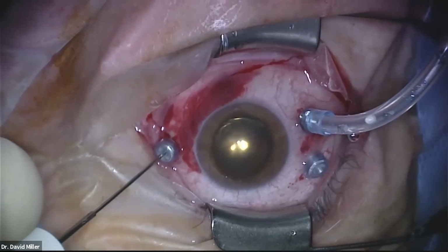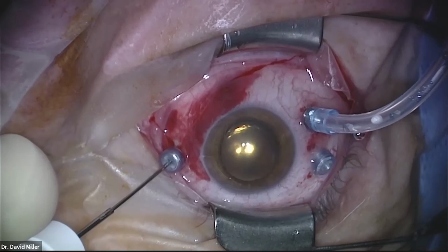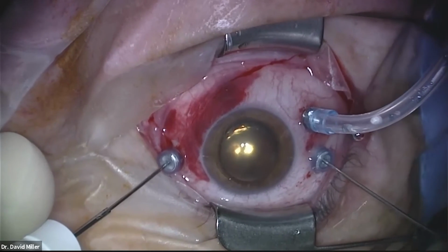Let me dry them out one more time. You've got to sleep on your left or right side, but we want your nose kind of on the mattress, your face towards the mattress as much as possible. Now, since his breaks are directly at 6 o'clock, more inferior, we do like to leave these patients with as large a gas bubble as we can. And so I go back and dry one last time.